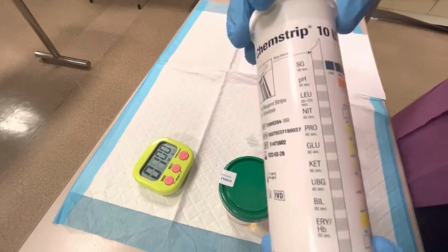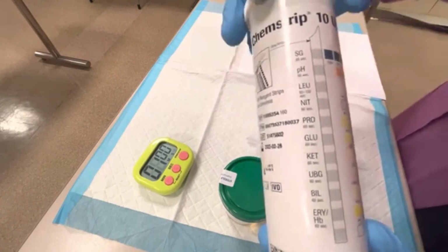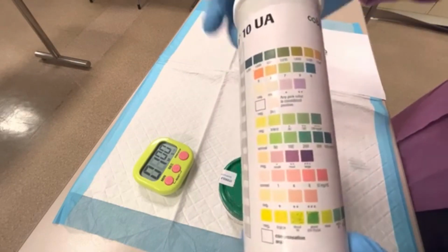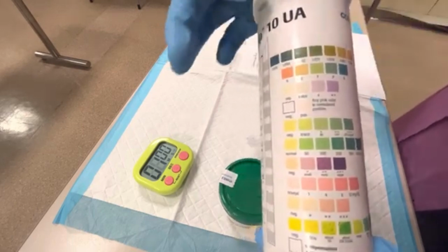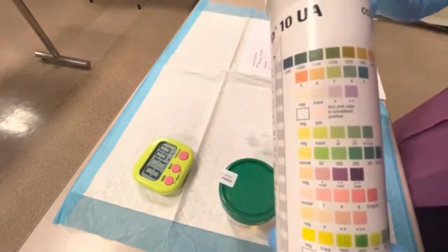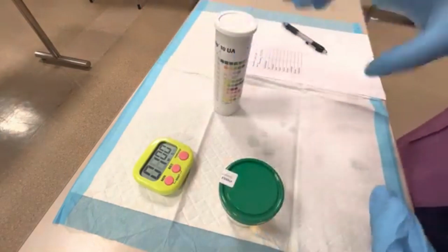So what we're going to do is dip the strip in the urine, and we're going to set the timer, and then we're going to compare the color of the reagent pad to these levels, and that's how we get our result. So I'm going to go ahead and do that here.